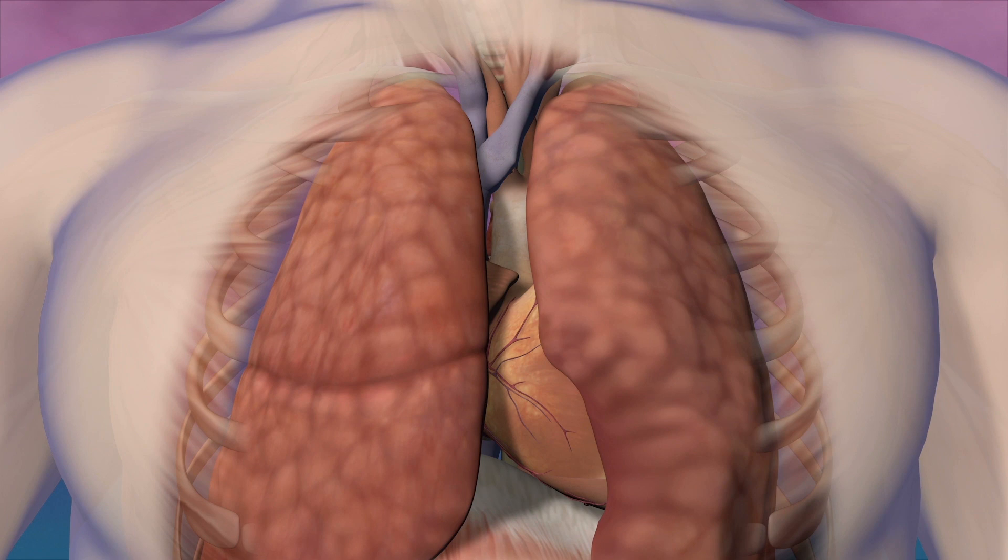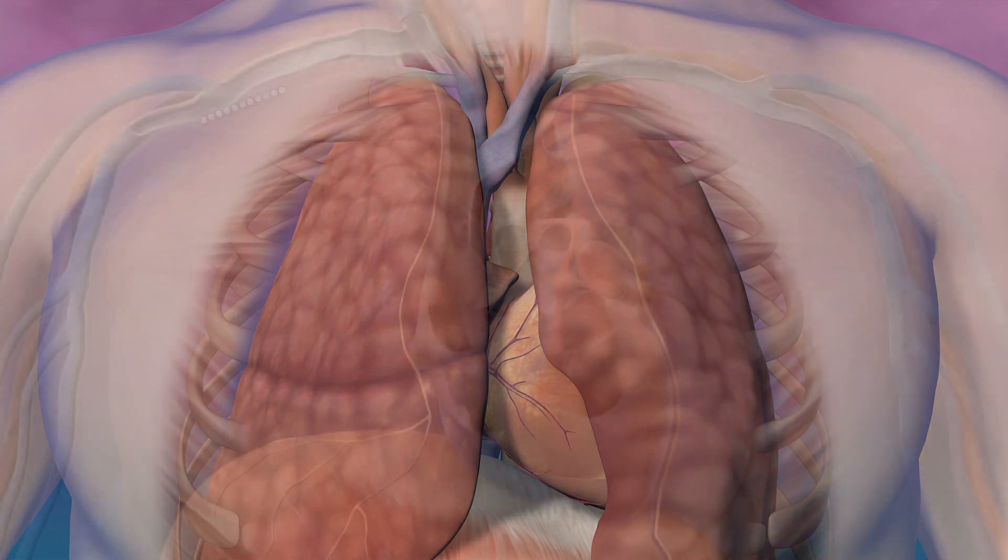The first step of the procedure is placement of a stimulation lead. An incision is made in the pectoral area and used to gain venous access.